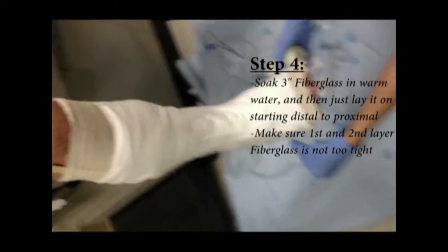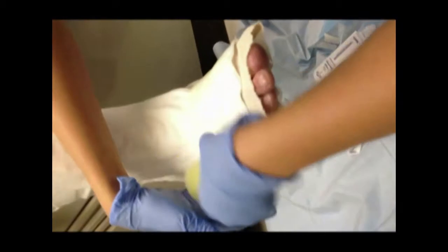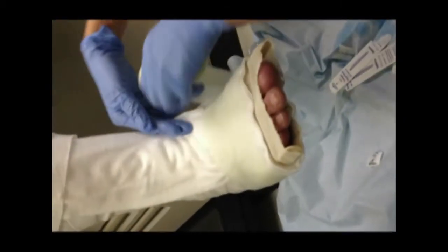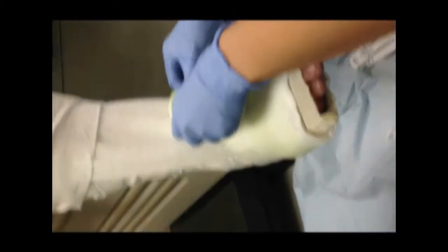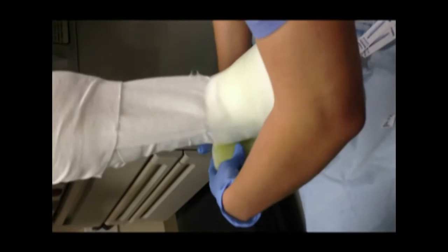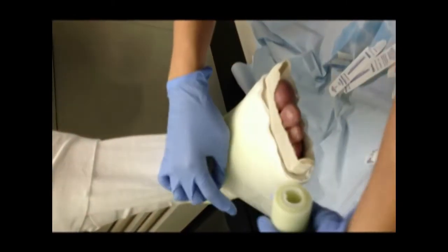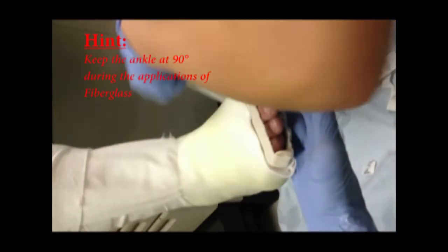Just like the web roll, start rolling the fiberglass on from distal to proximal. The key to rolling on the fiberglass is making sure the first, second, and third layers are not too tight — just lay it on as it rolls on naturally. We don't want to make a cast that's going to be too tight around the foot. And again, make sure we preserve the 90 degrees of dorsiflexion.